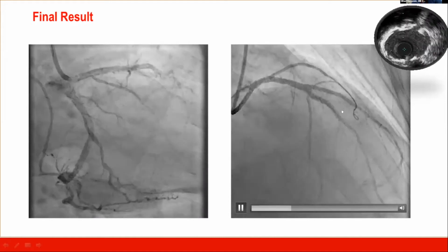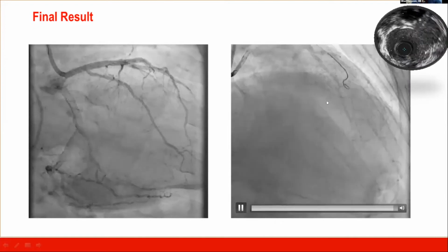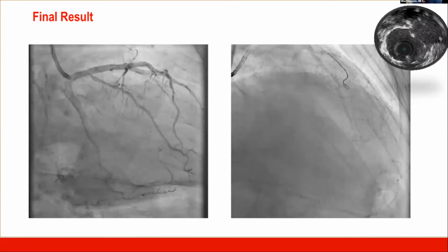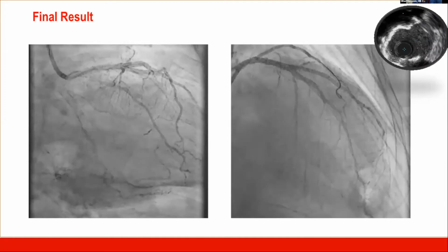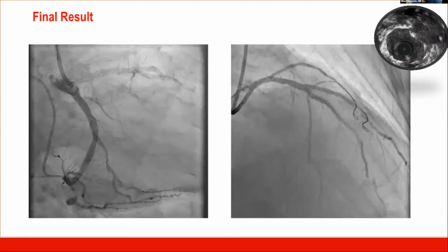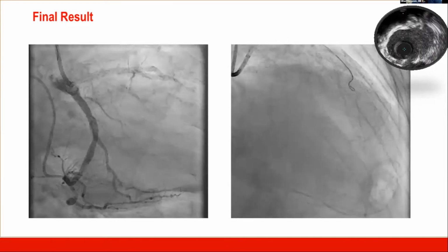We tucked a small stent here from just at the end of the main LAD into the distal LAD to deal with a moderate residual disease. And we post-dilated vigorously. The IVUS run, as you can see, and I just took the clip for the bifurcation, so good stent expansion and a position at the bifurcation side.